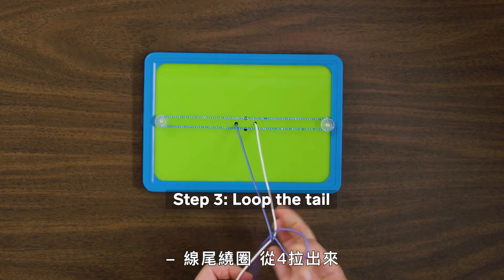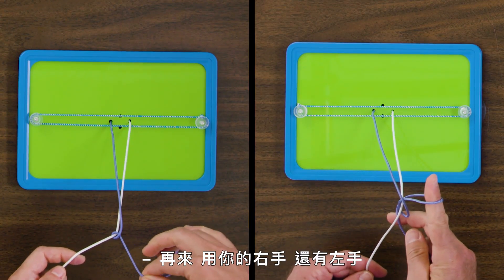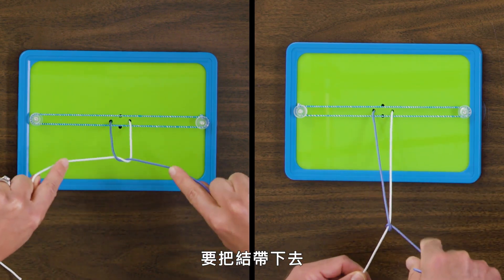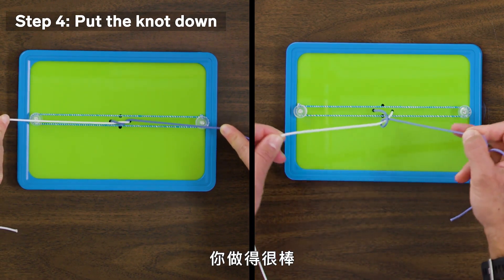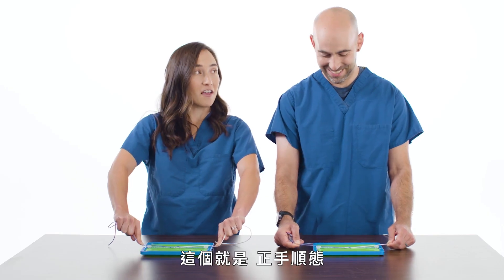Your index finger is going to go through the four, loop this tail, and bring it through the four — just like that. Bring the whole tail through. With your right hand and your left hand, put the knot down and it should be nice and square. That's excellent, Peter. I'm a doctor! You're a doctor! So that's your forehand throw.